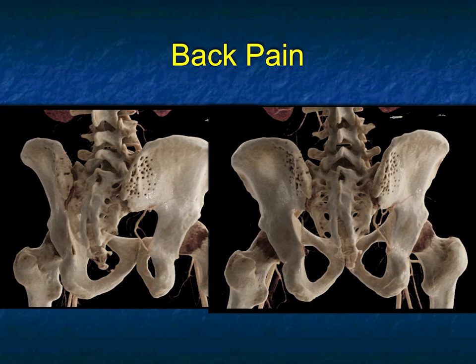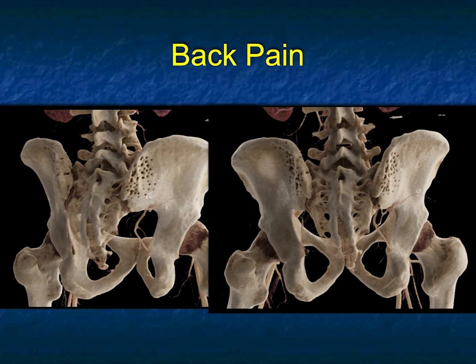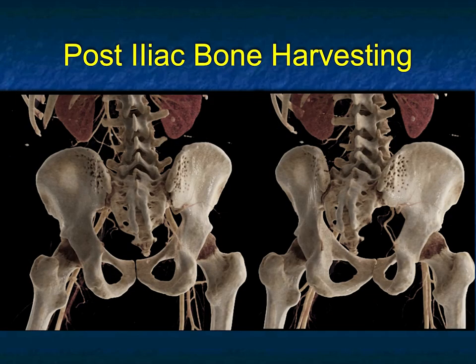Patient has back pain — what's going on? What are all those little dots in the posterior aspect of the left iliac crest and also on the right side? It doesn't look like infection and it doesn't look like metastasis. There are so many little dots over a strategic area. I show you this case because once you've seen it, you'll never forget that appearance — bilateral tiny lesions. It looks like the patient had bone marrow harvesting, and that's what this was. We've often seen hemorrhage, which was the issue in this case, or suspected hemorrhage — patient having pain post-procedure. Looks like a painful procedure, and obviously it is.